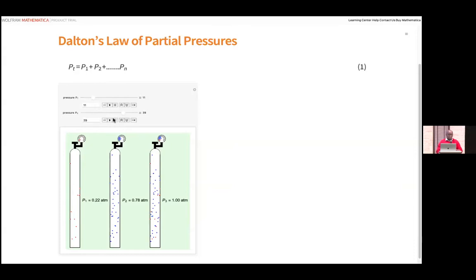So what happens if I increase the oxygen? I'm trying to push it all the way to 100%. At the same time as I do that, I will have to remove my nitrogen. So when you pre-oxygenate, I'm basically depleting the nitrogen from your FRC. So maybe if this is the way it was taught, I'd have gotten maybe 40% instead of 30, but yeah. So as we say, give oxygen, or pre-oxygenate, this is the basis for prolonging your apnea time when you sedate and paralyze a patient.